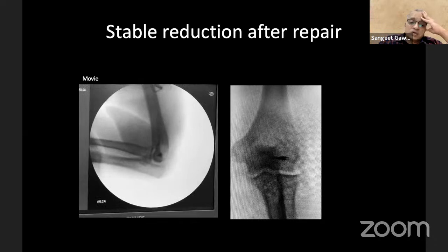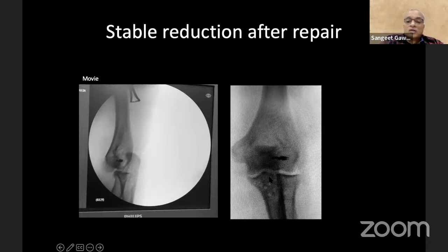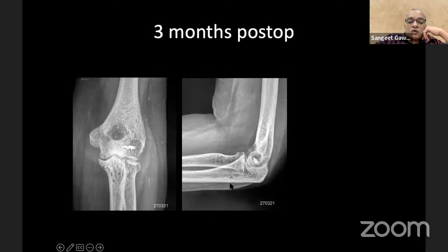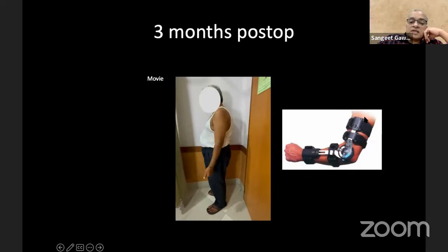So this is how it is reconstructed at the end. The elbow is stable. These multiple drill holes, what you see, are for the pull-through sutures. Okay. And that is tied over the posterior surface. So this is his X-ray at 3 months. And that is his range of movement at 3 months. So this is the brace which I was talking about, where you can control the flexion and extension of the patient.